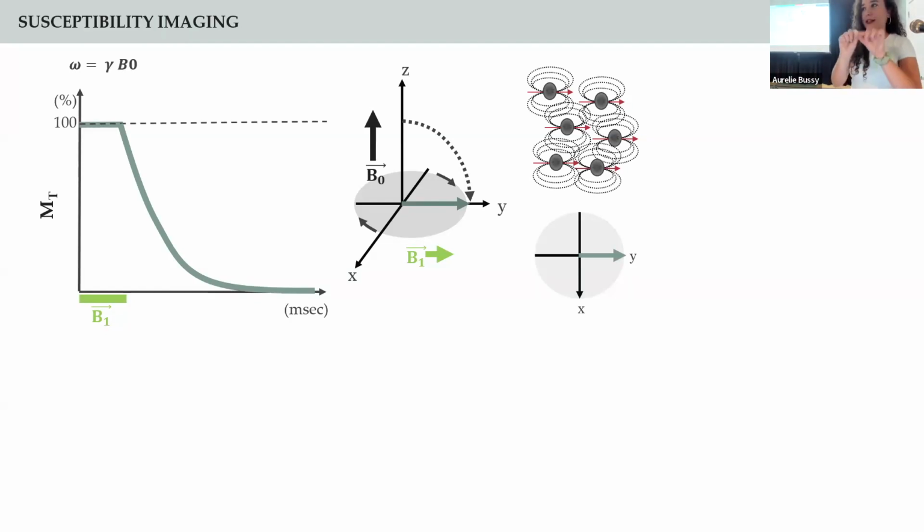So they create tiny magnetization around them. And this magnetization is going to be also impacting the surrounding spins. So it's kind of a complicated mess at this point, but each spin will impact the other. And you can think about the magnetization as additive. So the more magnetization in total, the more dephasing you will have.